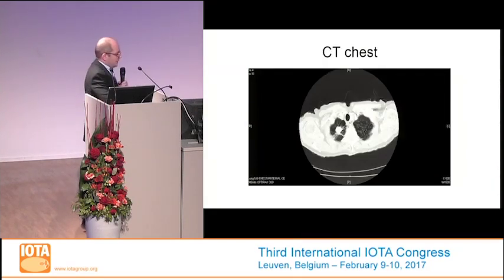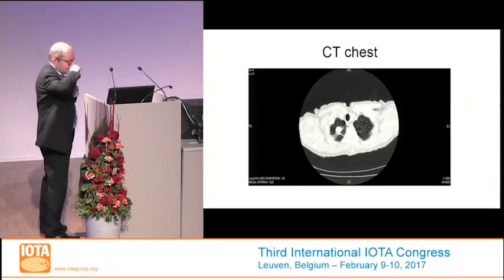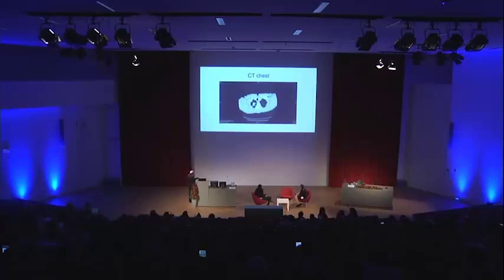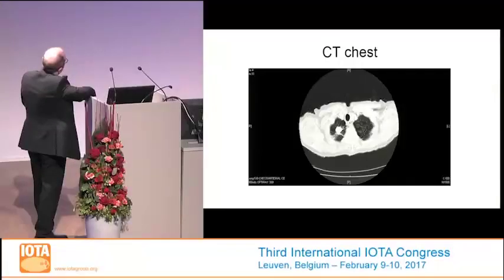But as well, we did the CT chest, and we found a lump there. Very suspicious nodule. Yeah, in the upper right apex, part of the right chest. So we decided as well, we thought this is a biopsy. Bit of a weird pattern, so we decided to biopsy this one as well.